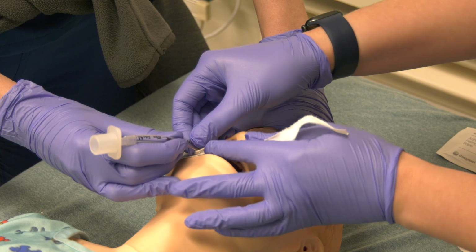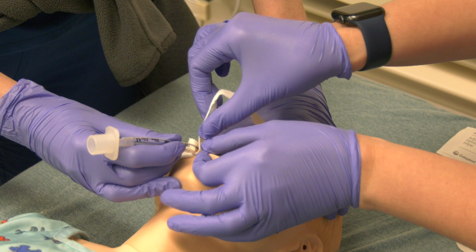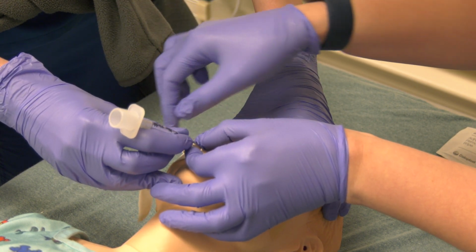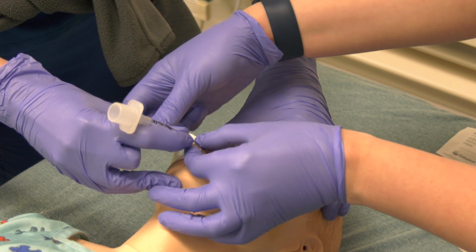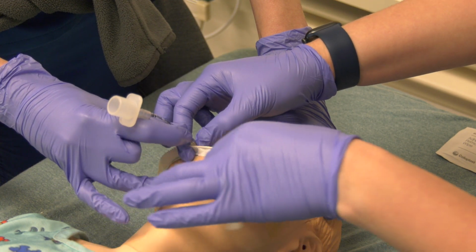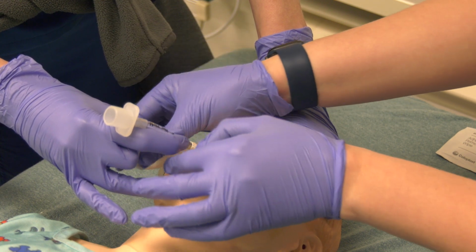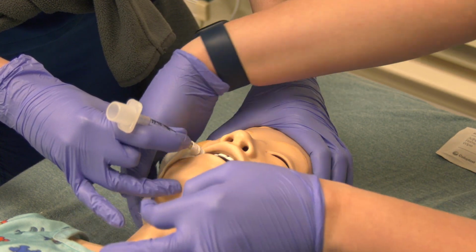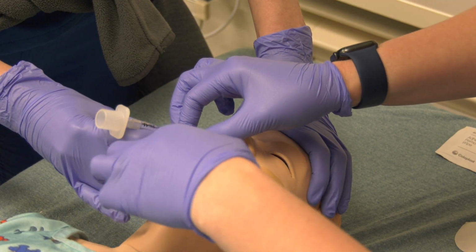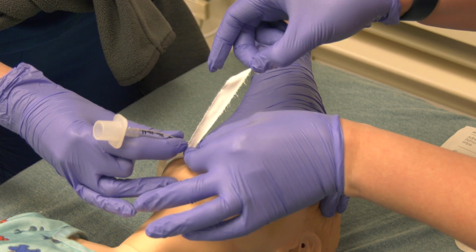And you want to get as close as possible to the tube. And then you will begin to wrap around. You will move it up, but the first wrap around, you want to ensure that it's at the base. And then you will Christmas tree it up at least twice around. Two to three times around on the first piece.